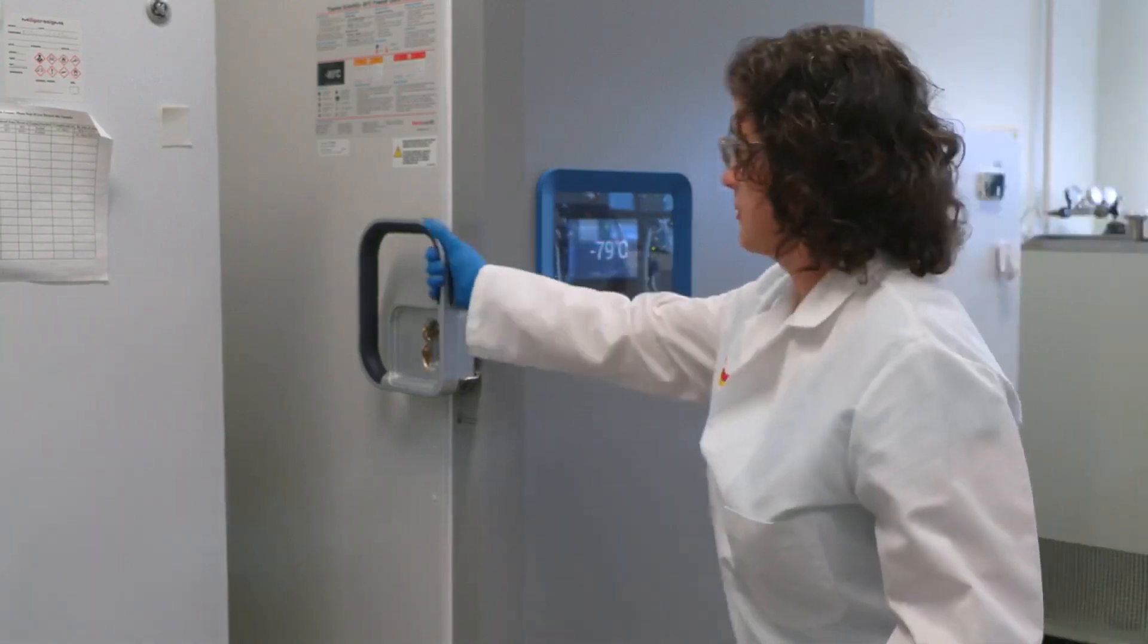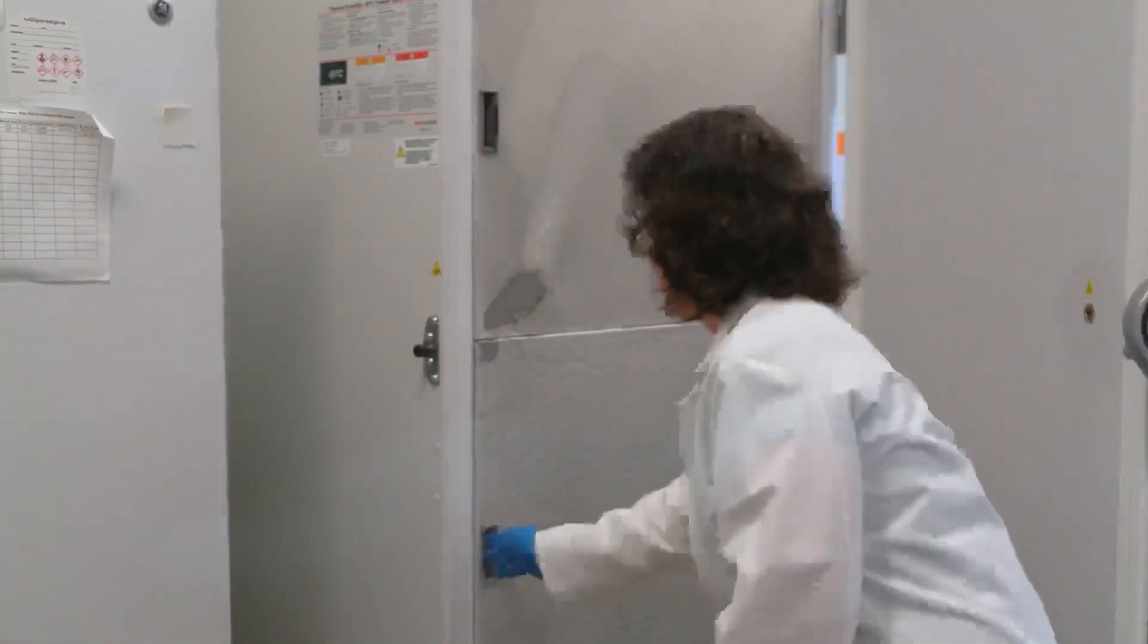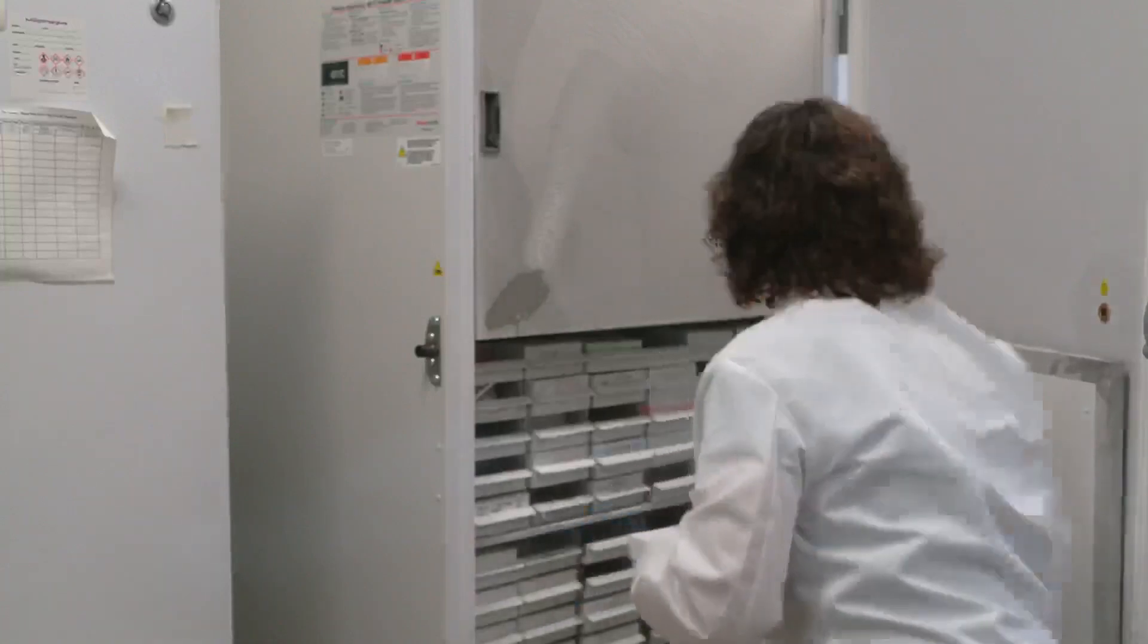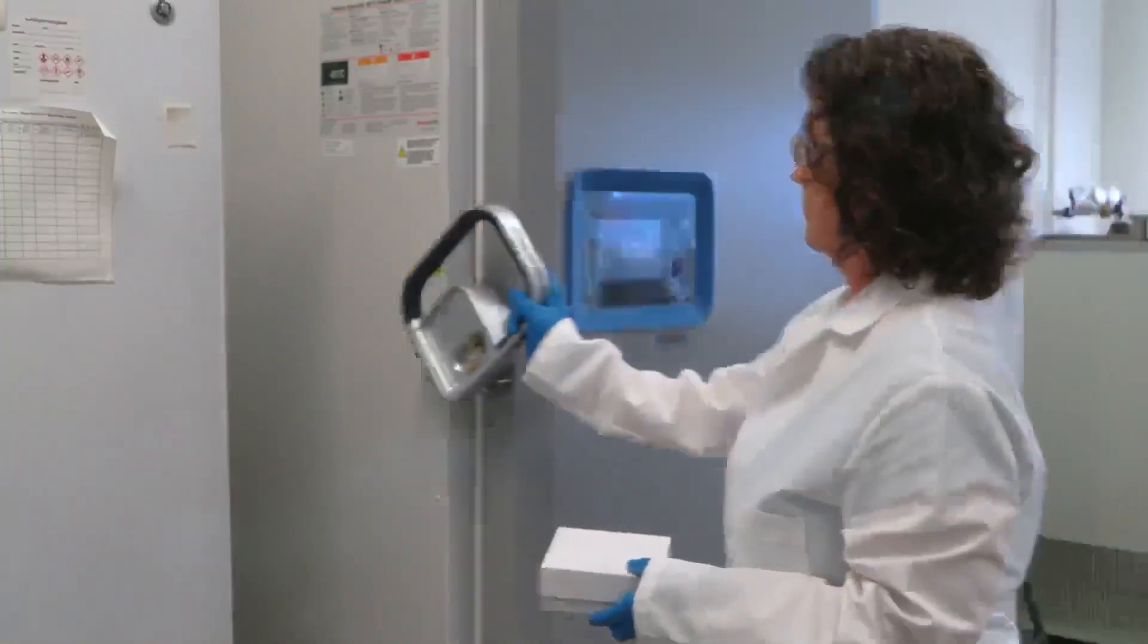After serum or plasma samples are separated, they can be assayed immediately, or the samples can be aliquoted and stored at minus 20 to minus 80 degrees Celsius.